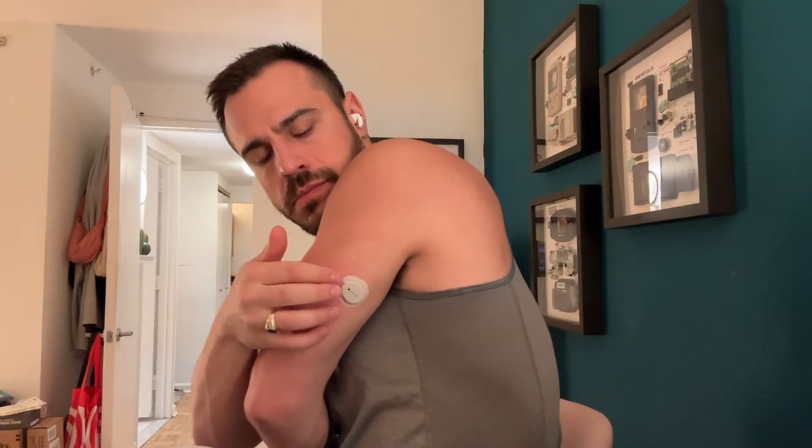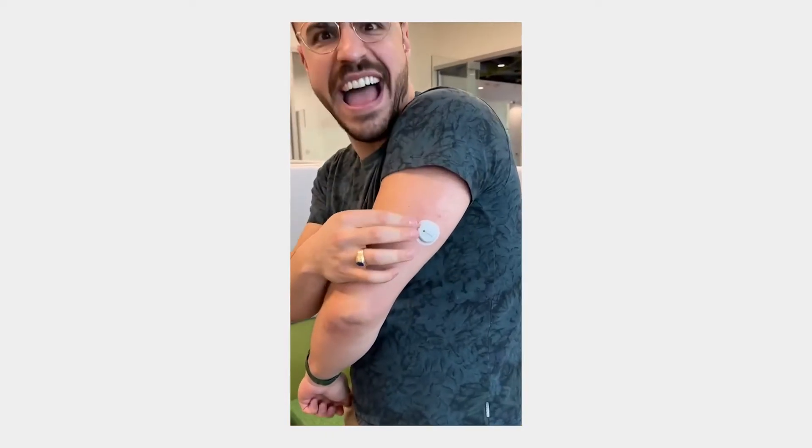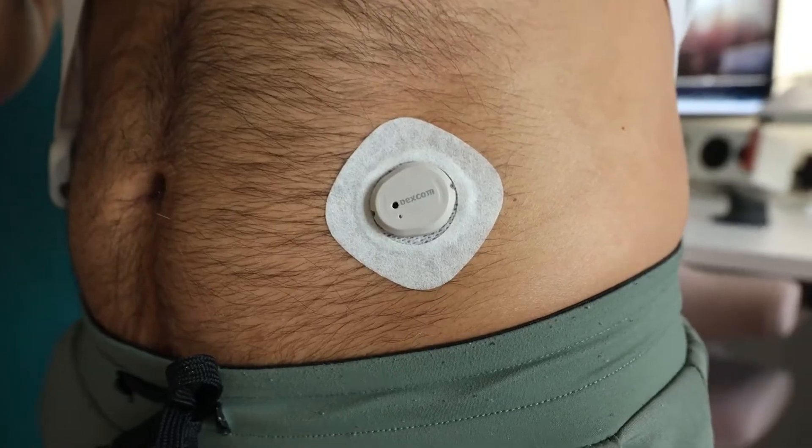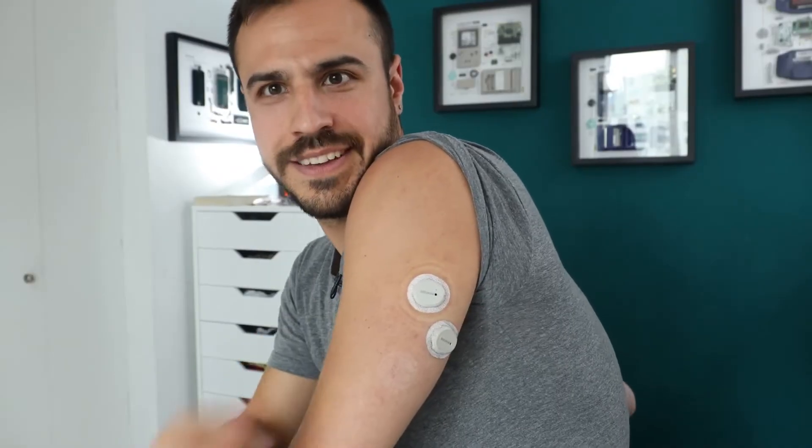I've been putting this thing on for nearly eight months. In that time, I've had one, maybe two hurt when I put it on. Besides that, every single other one has been completely painless. It's amazing. It goes in at a 90-degree angle instead of a 45-degree angle like the G6 — something about that angle and the shortness of the piece that goes into your skin means it just doesn't hit muscle anymore. This device is technically only approved in the US for behind the arm; in Europe, it's also approved on the abdomen. I've used it all over the abdomen and on my arms with fantastic results.